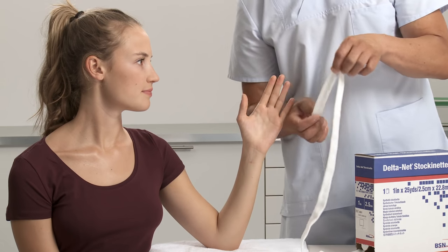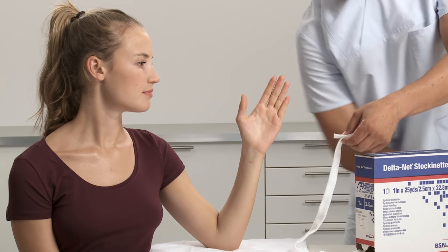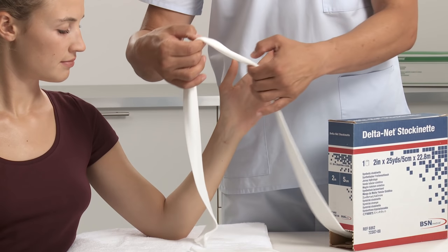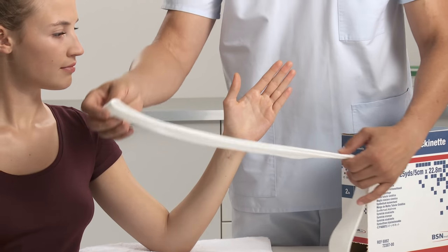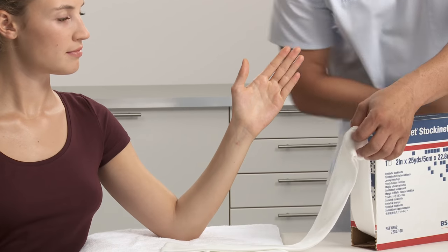Take double thumb length of 2.5 cm or 1 inch width of stockinette and cut. Then choose the appropriate width of stockinette for the arm. Measure the length from elbow to fingers, add another 15 cm or 6 inches, then double this length and cut.